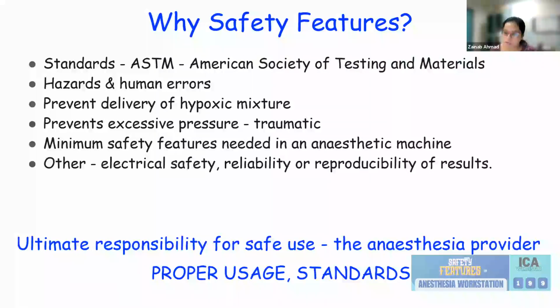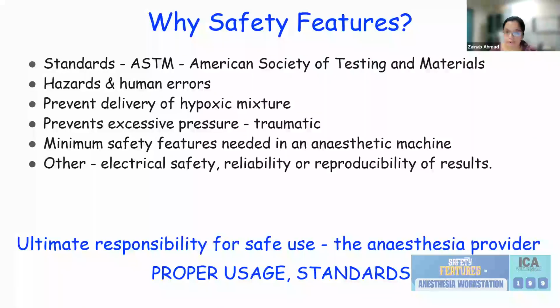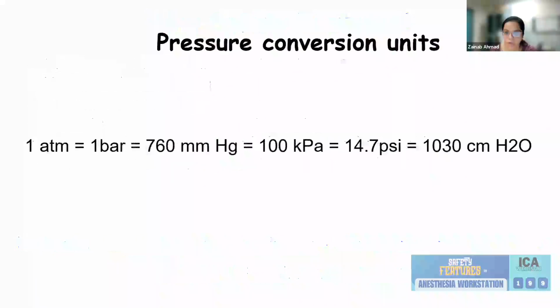And apart from the safety features that are inbuilt in the machine, we also have to be aware of the proper usage and standards. The standards that every machine should meet are governed by the American Society for Testing and Materials, and we recommend that the machines should obey those standards.